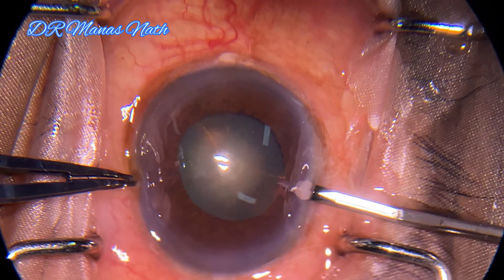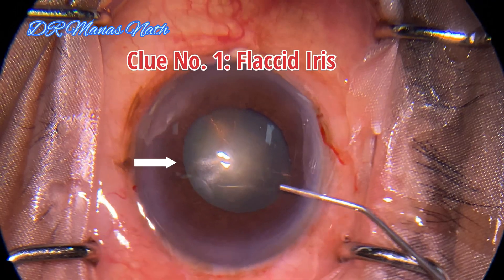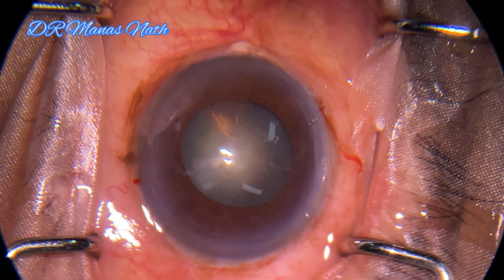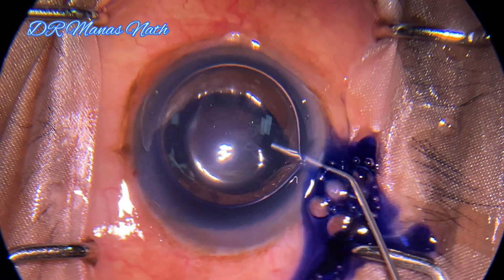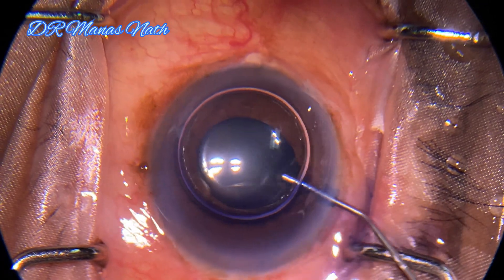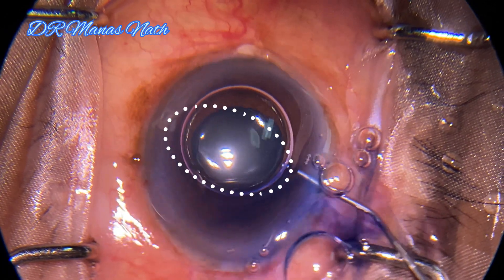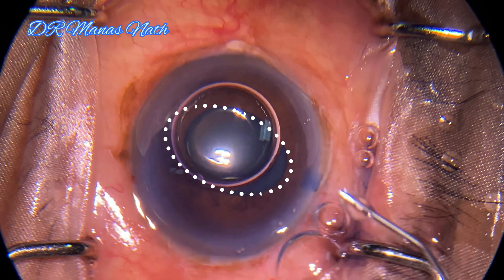The first clue is that when you're injecting fluid, you can see that the iris margin is quite flaccid. And on staining the capsule while I'm removing the dye, you can see that there is a bellowing of the iris and the iris started prolapsing towards the sideport, and the pupil has become quite oval.